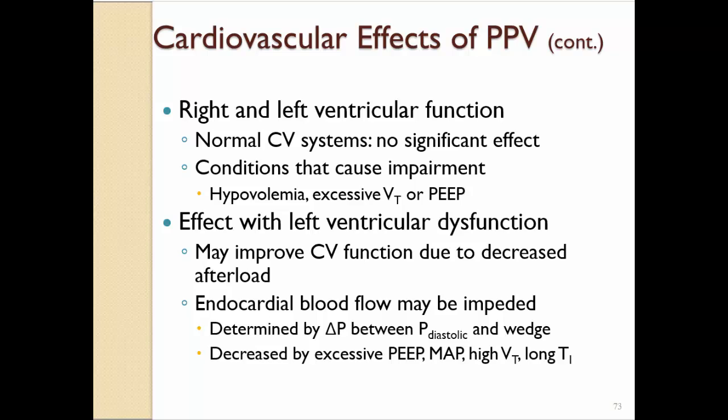Effect with left ventricular dysfunction. This may improve cardiovascular function due to decreased afterload. Endocardial blood flow may be impeded, determined by the delta P between the diastolic and wedge pressure. It is decreased by excessive PEEP, mean airway pressure, high tidal volume, and long I times.